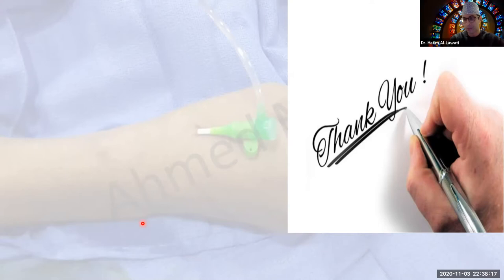If it was me in that situation and I had access to the Impella, and I'm largely biased by the data that was published from the Henry Ford Center by Bill O'Neill, a very prolific group in research in mechanical circulatory support, I would have actually put in the Impella device. Yes, you want to restore flow. And luckily in this situation, things went very well after the left main was stented.